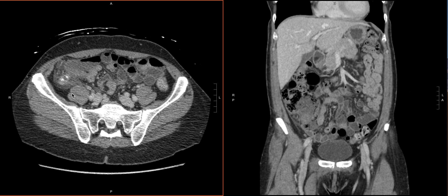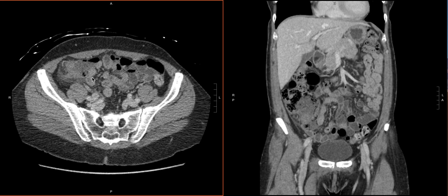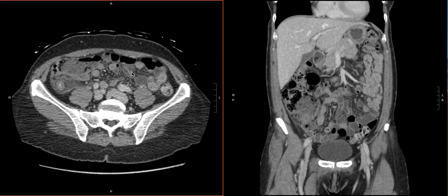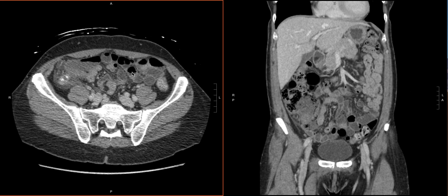What I mean is that we first want to be systematic in identifying the terminal ileum and the ileocecal valve, so we don't confuse the appendix for terminal ileum. To do that, we will scroll back and forth and look for a few structures.